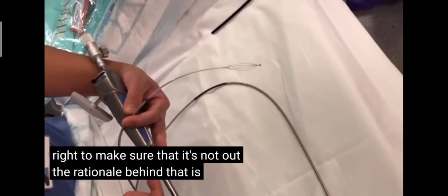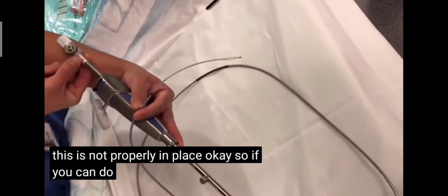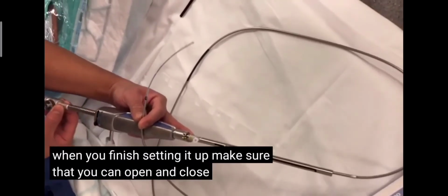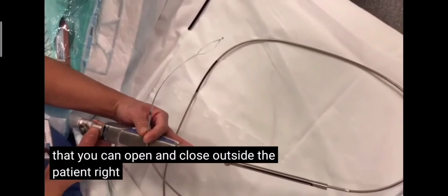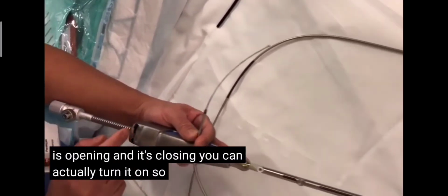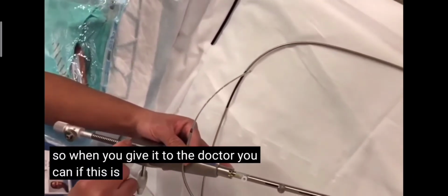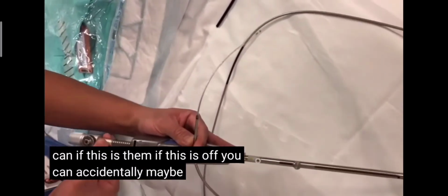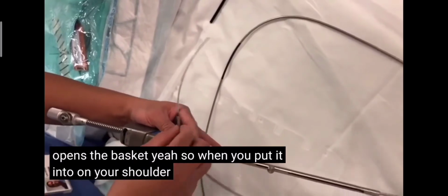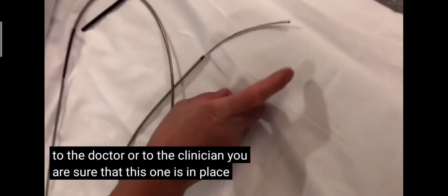The rationale behind that is that probably this is not properly in place. When you finish setting it up, make sure that you can open and close it outside the patient. When you're happy that it's opening and closing, you can turn it on so it won't move. If this is off, you can accidentally push this and it opens the basket. So when you put it on, you're sure, when you give this to the doctor or clinician, that this one is in place.